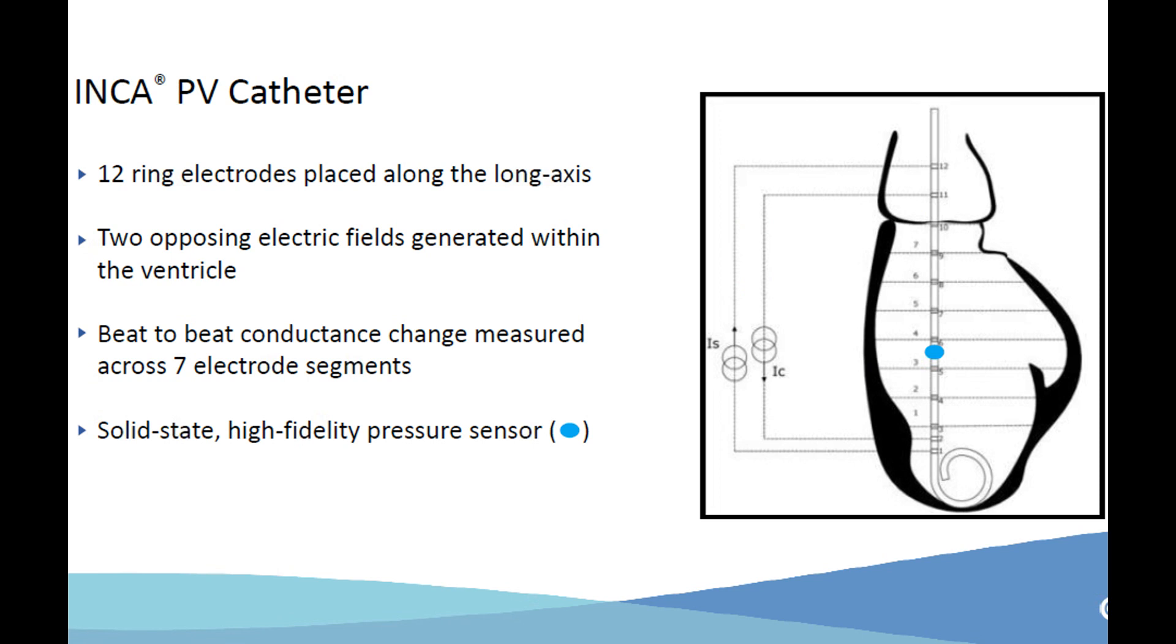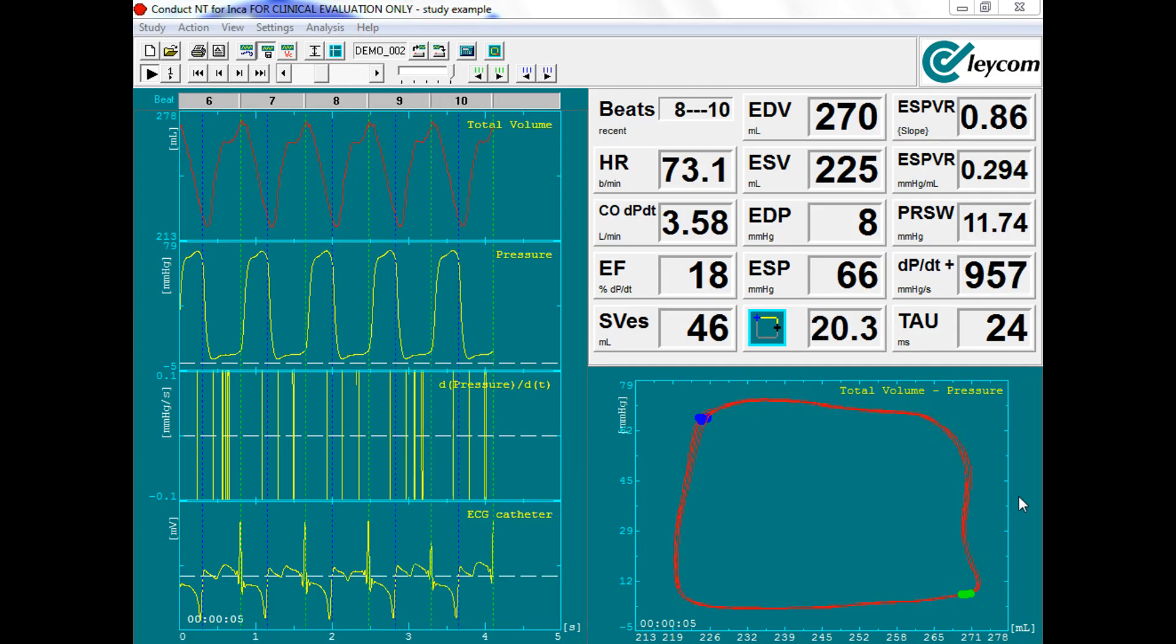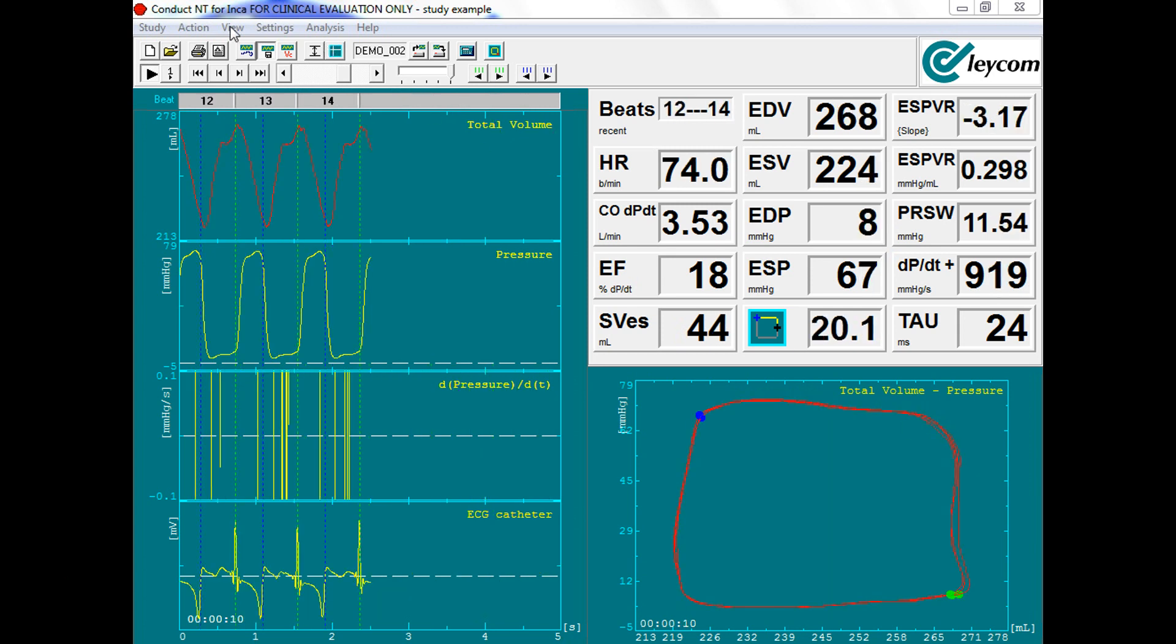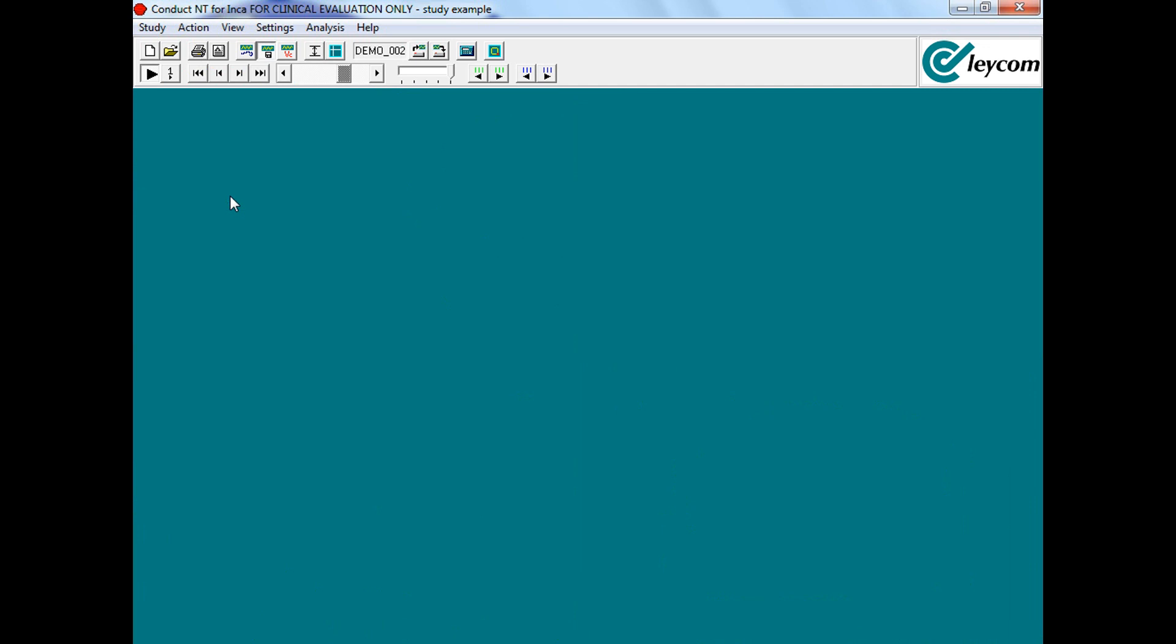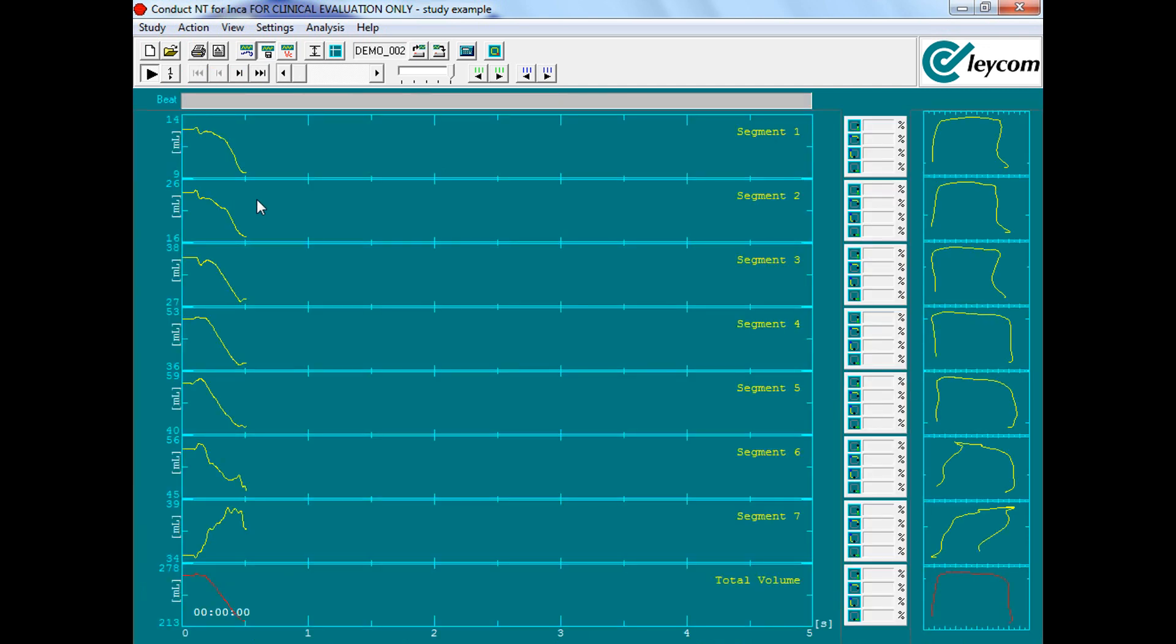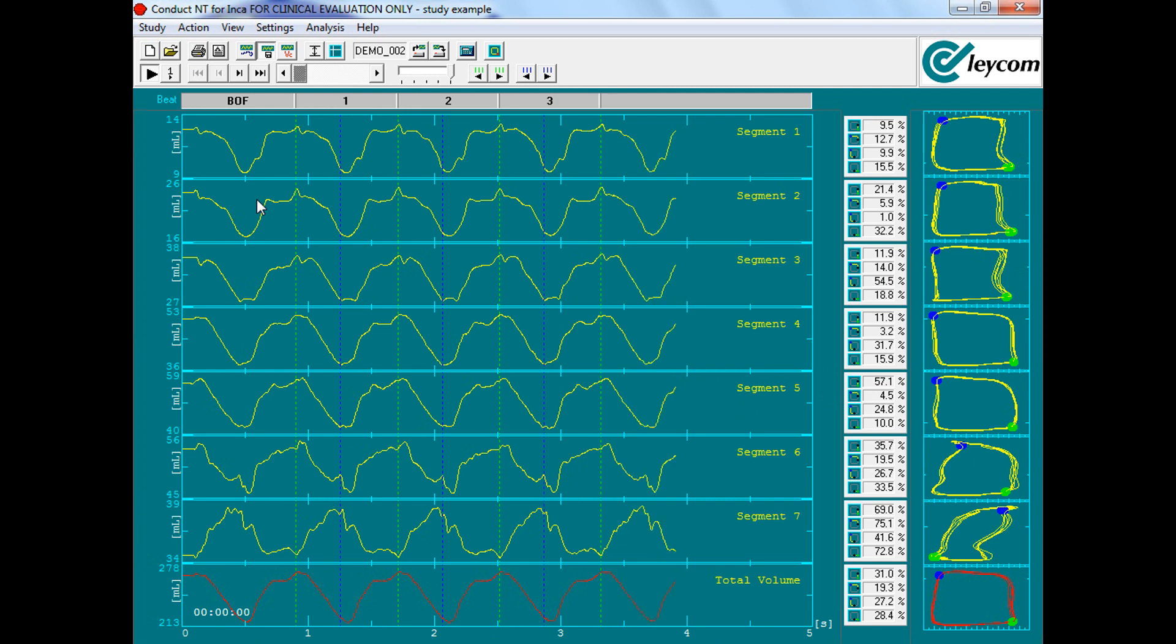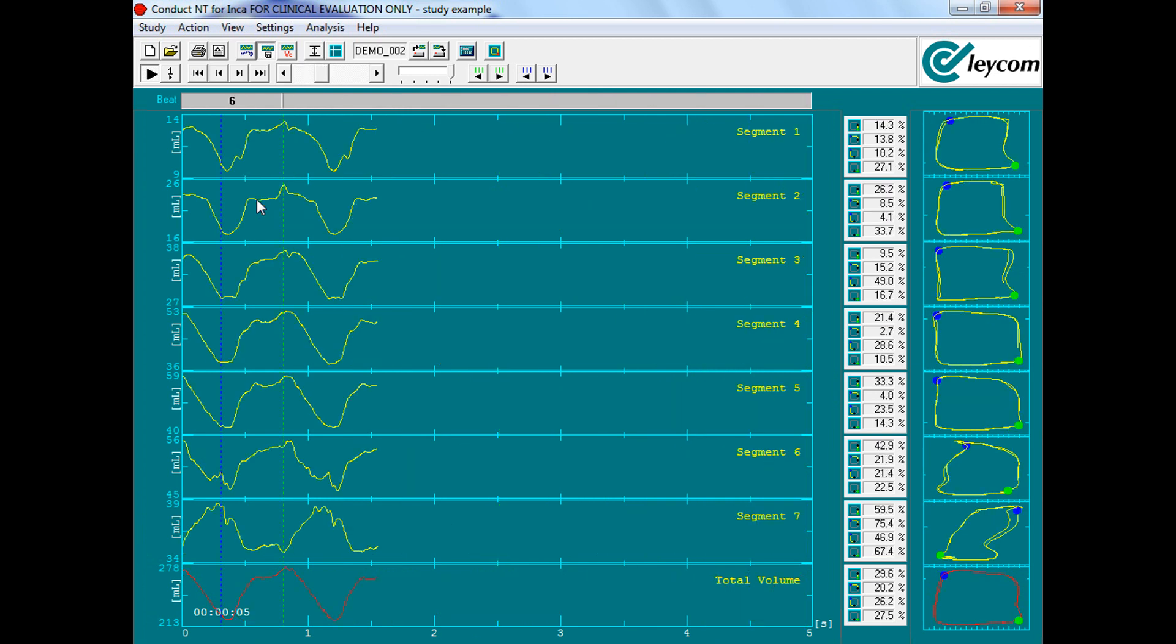Next, the PV catheter should be delivered to the appropriate ventricle such that the pigtail is at the ventricular apex and the catheter shaft is centered along the ventricular long axis. Initially fluoroscopy should be used to determine catheter positioning. Then we will confirm catheter positioning using Conductant T by going to view segmental loops. This view plots the single pressure signal with each ventricular volume segment to provide a series of PV loops that help determine the PV loop catheter positioning.